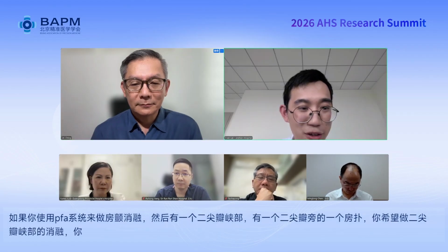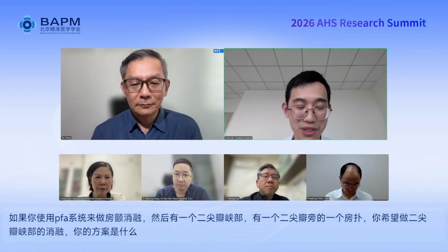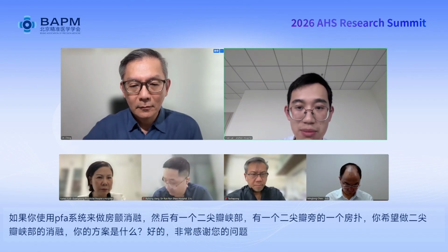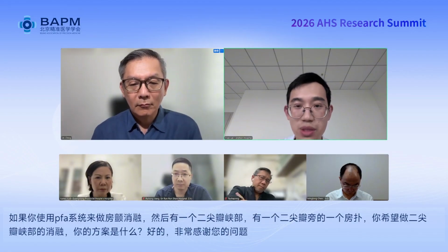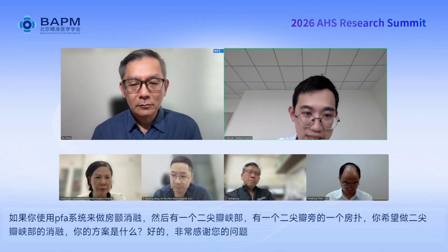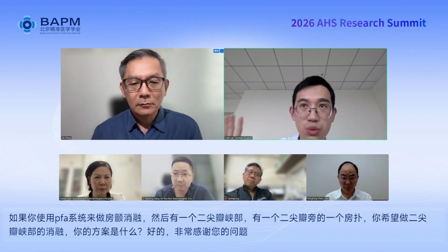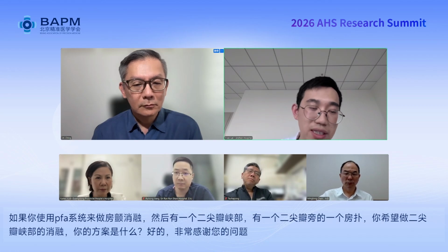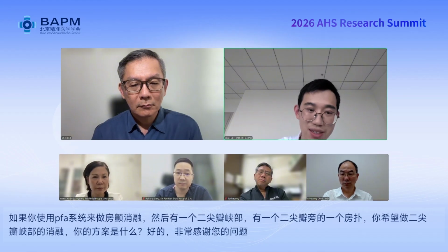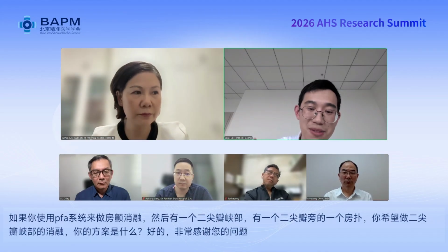Thanks very much for this question. This is very good. In our center, for all the mitral line operations, including perimitral flutter, we will do ethanol infusion first, and then afterwards we will do the endocardial ablation, because the venous angiography can help us understand better the anatomy and the distribution of the coronary venous system.